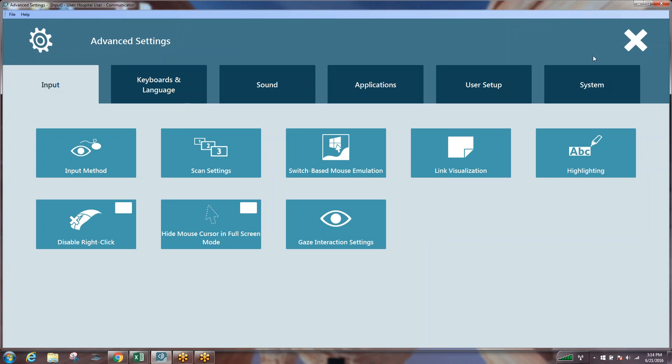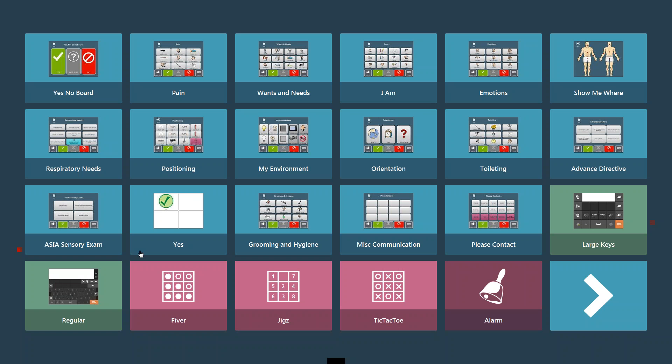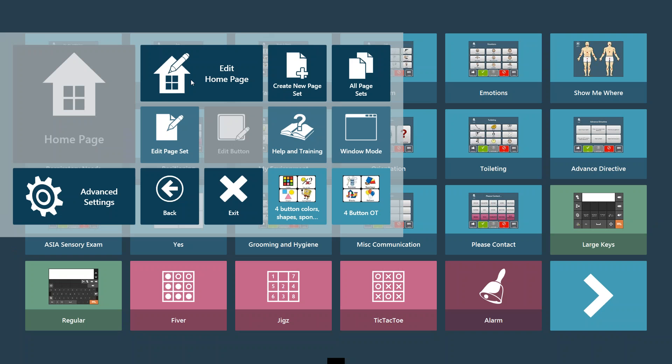If I bring up Communicator 5, we'll see that I'm just on a random set of pages, so your page may look different than mine. What I want to do is go into my quick menu. If you're on an I-Series device, on the left side of the device you want to select the three buttons, the three dots, and it will bring up the quick menu guide. If you're on a computer, you can right-click or hit Control-M to get to this menu. Now depending on which version of Communicator 5 you're running, if you've completed all of your updates, we're going to enter into what is now called our advanced settings. If you were running a version prior to Communicator 5.2, instead of advanced settings, we'll say caregiver settings. It still takes you to the same thing, we've just renamed it.